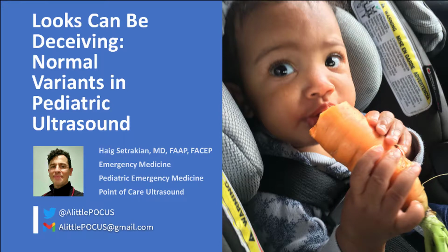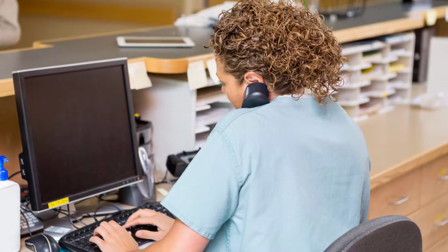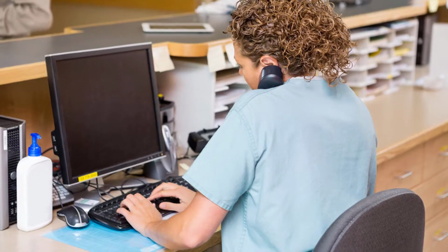Today we'll be reviewing a case from the community to highlight some of the unique challenges posed by the Pediatric FAST exam. An ambulance crew calls ahead to your facility to give report on an infant they're transporting from the scene of a motor vehicle accident. The patient appears stable, but was noted to have a faint mark over their lower chest and upper abdomen under the car seat restraint. They also vomited.